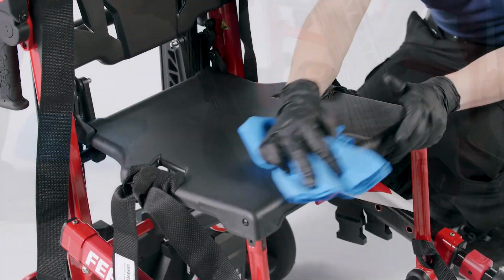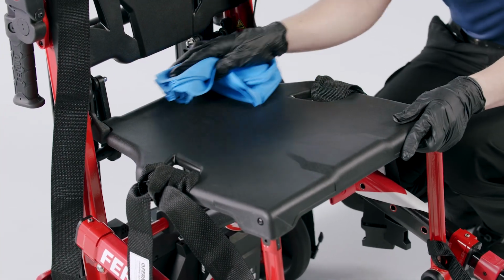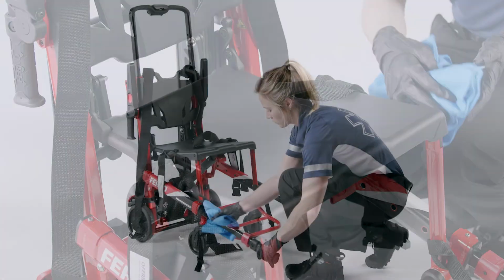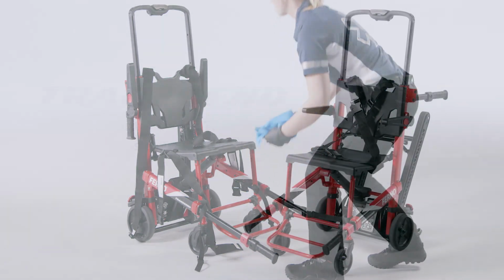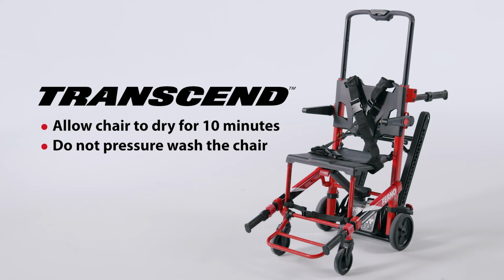Hand clean all surfaces of the chair with warm water and a mild detergent. Rinse with warm, clear water and dry the chair with a towel, or allow it to air dry for 10 minutes. Do not pressure wash the chair.